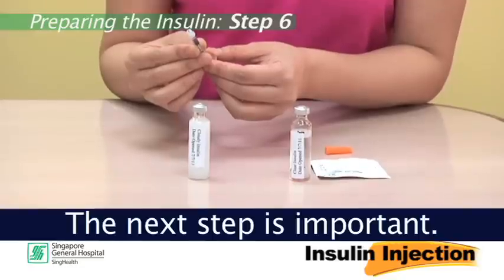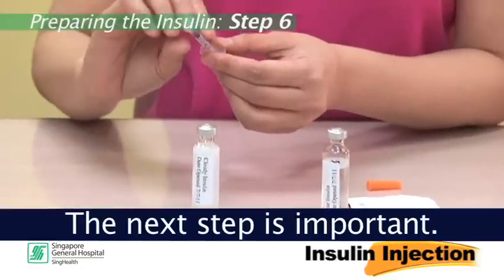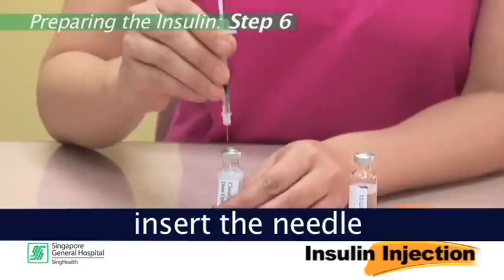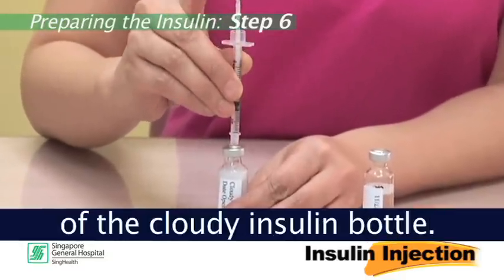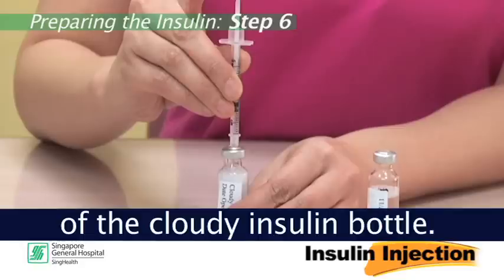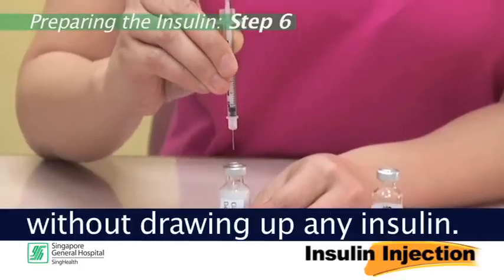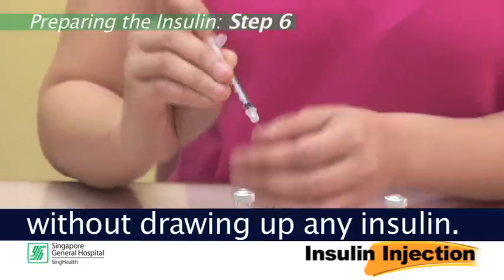Step 6: The next step is important. With the bottle standing upright, insert the needle through the rubber stopper of the cloudy insulin bottle and inject air into the bottle. Remove the syringe without drawing up any insulin.